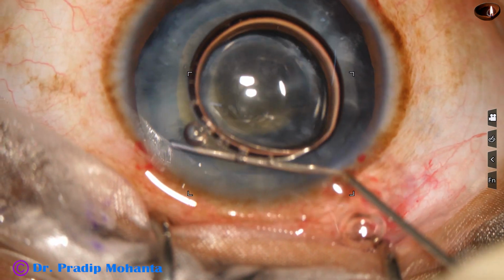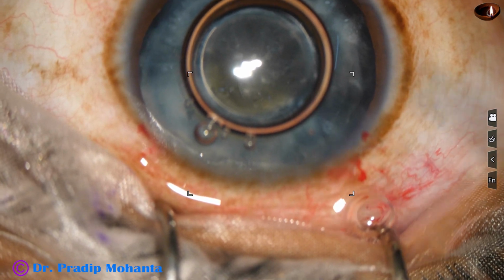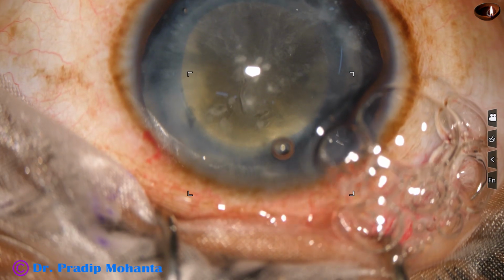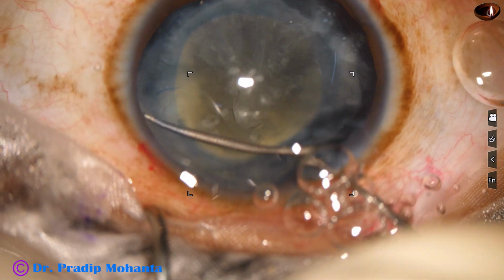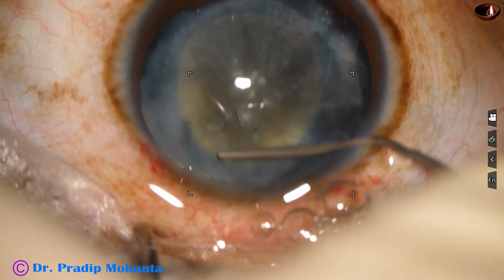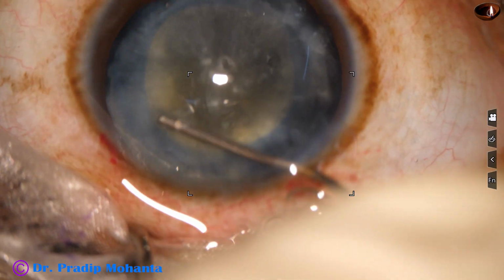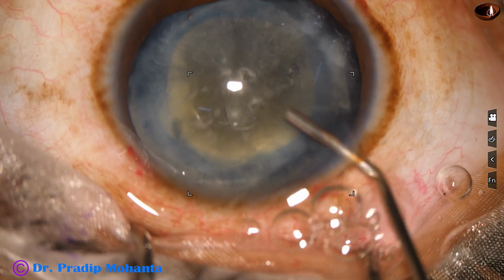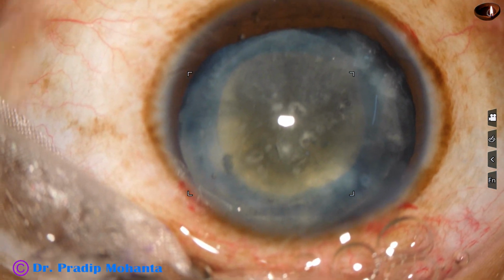Now hydrodissection is attempted. Suddenly an air bubble went inside the anterior chamber. We remove the air bubble and again attempt hydrodissection at multiple points. There is firm corticocapsular adhesion in this case, and the nucleus resists to rotate. The nucleus doesn't want to rotate.